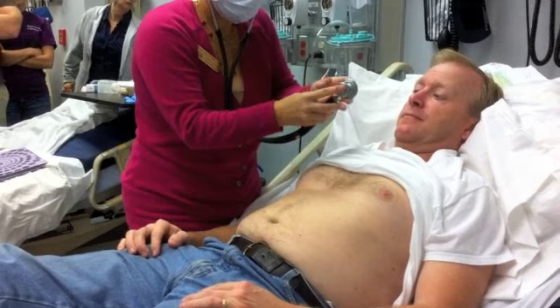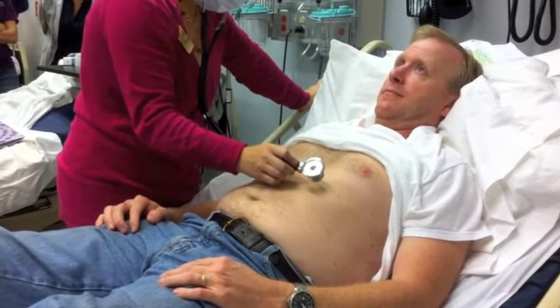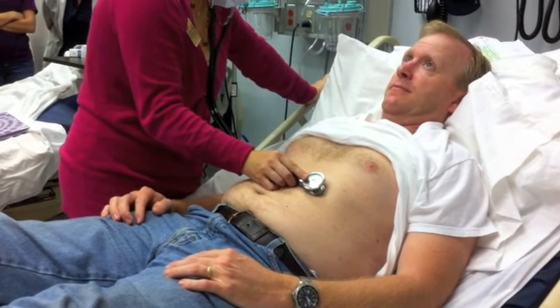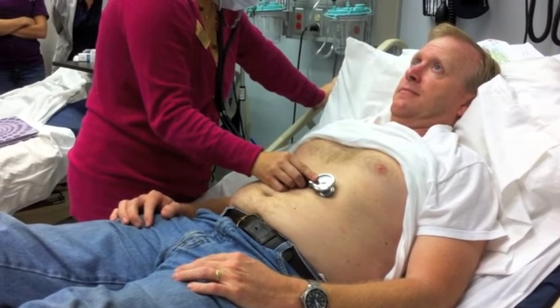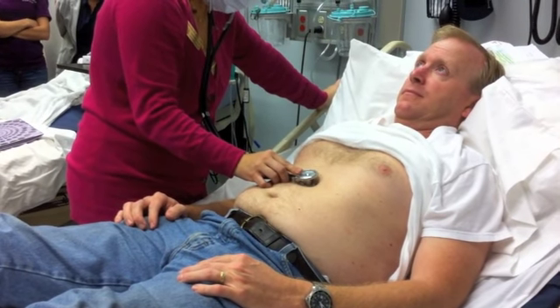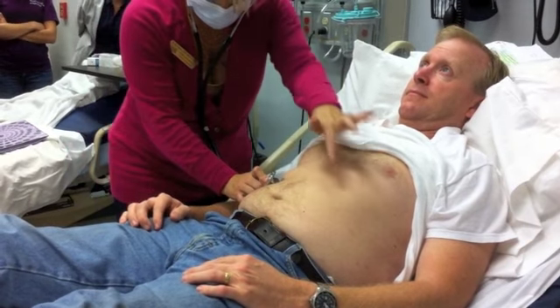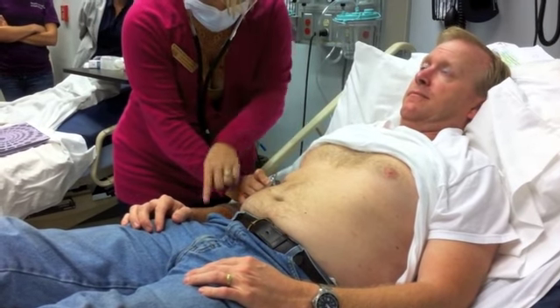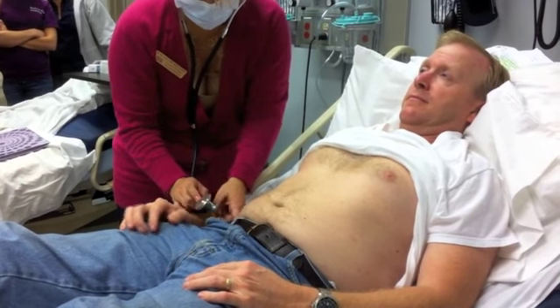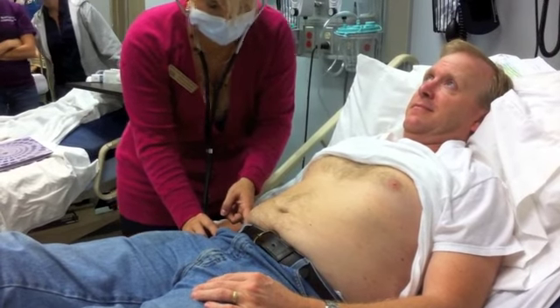Now I'm going to go back with my bell and listen for bruits as well. Spleen, aorta, liver. Now I'm going to go to the femorals. These are the femorals way down in here, so I'm going to save Pete from unbuckling his pants.